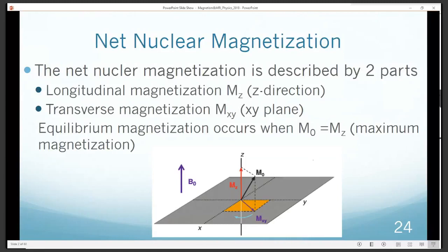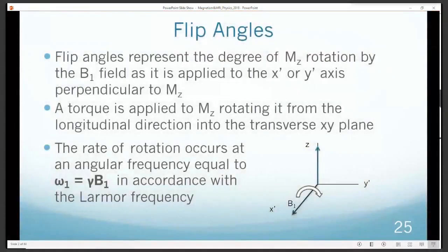And it's the component of the magnetization in the XY plane that actually produces the NMR signal. After you turn off the RF pulse, you'll get the signal for a little while, but after a while there'll be dephasing, as we've already talked about, but there'll still be magnetization in the transverse plane. But slowly the magnetization will shrink. This purple vector, MXY, will shrink while the red MZ vector will increase again, and it'll get back to a state of equilibrium.